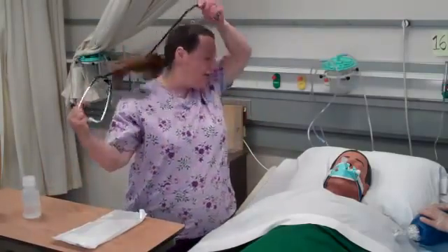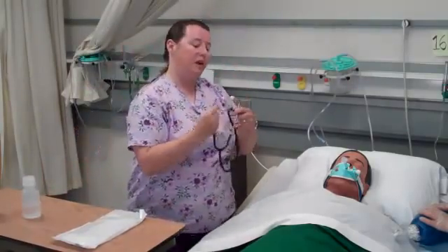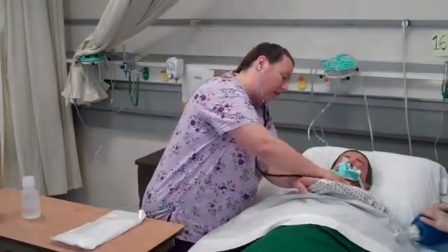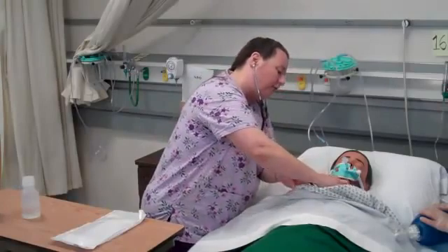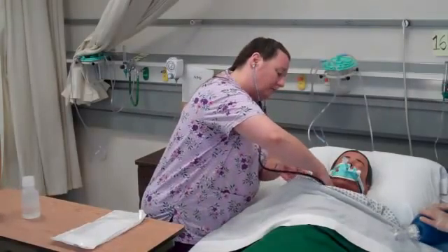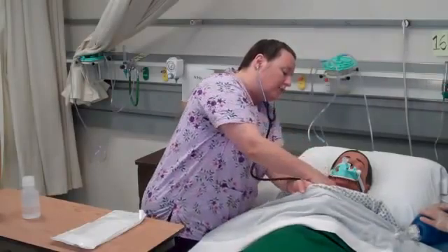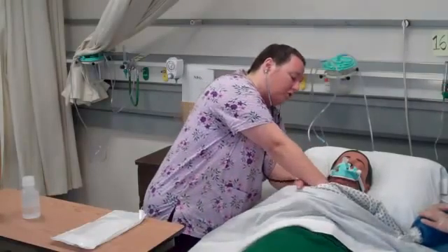Before I do any kind of procedure, I want to make sure I assess my patient. I'm going to use my stethoscope to auscultate for breath sounds. I'm hearing adventitious sounds — I could hear rales, I could hear ronchi, coarse breath sounds.